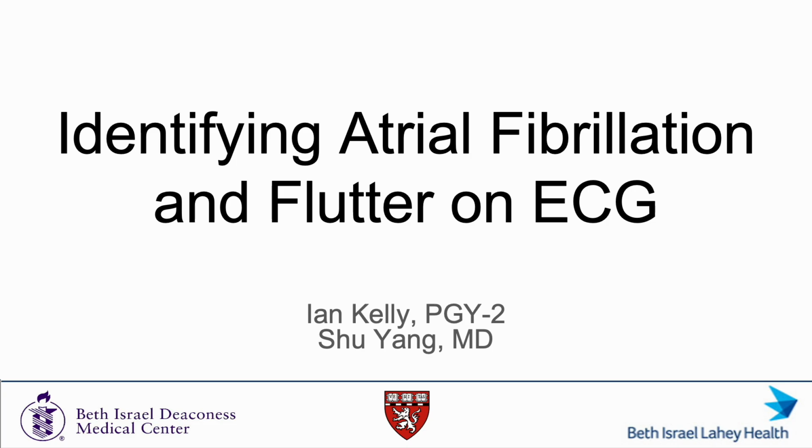Today I'll be joined by Dr. Shu Yang, an electrophysiologist here at BIDMC, and we'll be talking about identifying atrial fibrillation and atrial flutter on EKG. So we'll start off with some objectives for today.